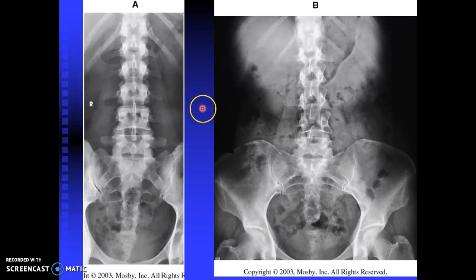Now, collimation is also important for the lumbar. While some facilities may keep the collimation open in order to identify incidental findings within the abdomen, in order to have an optimal contrast of your anatomy, collimation is necessary. And we're going to collimate to approximately a 7x17, similar to that of our T-spine.